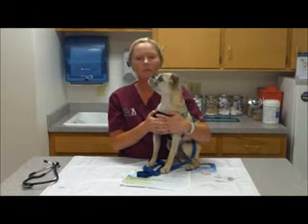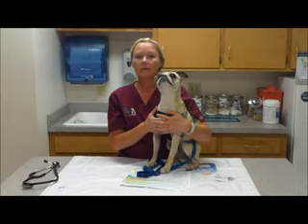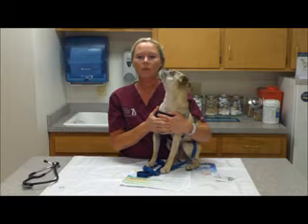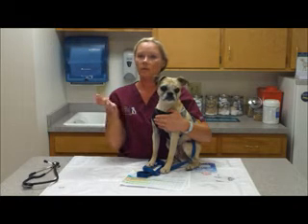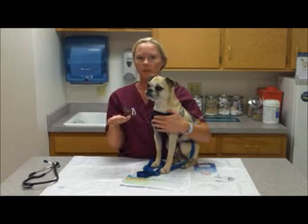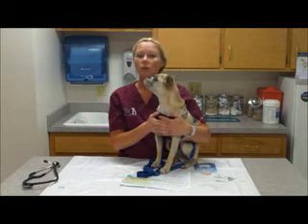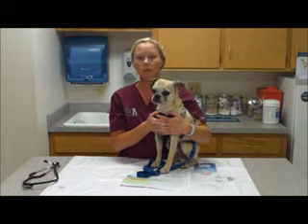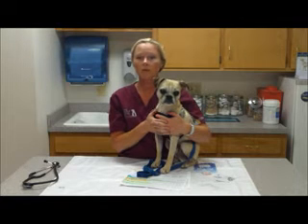Respiratory rate decreases with the depth as well. Normal is 8 to 20 breaths per minute. If there is an increase in the respiratory rate, it could be that they are coming from a moderate to a light anesthetic depth. So if we're still during the procedure, you may want to take them down a little farther. If they get below 6 breaths per minute, that is very dangerous and needs to be reported to the VIC.